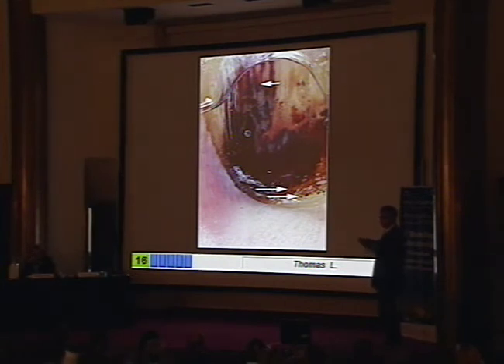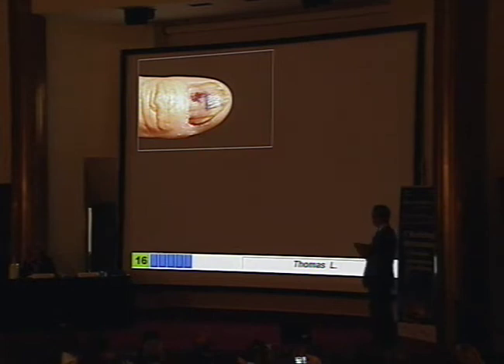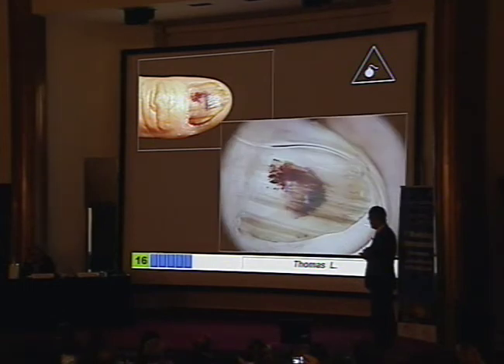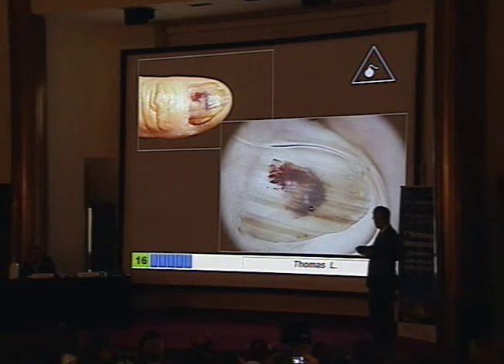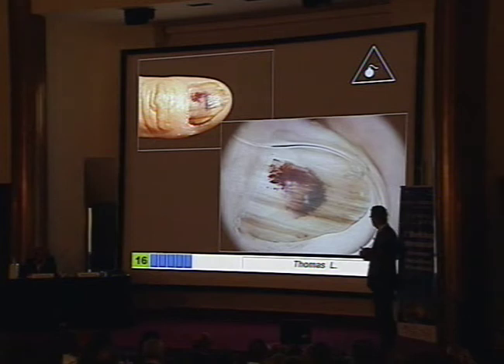Be stringent on other findings as well. A patient may have subungual hemorrhage for sure, but also have melanoma. You can see the lines — melanoma often bleeds, and having a hemorrhage does not rule out the diagnosis of melanoma. So always use your dermoscope when you look at a nail.